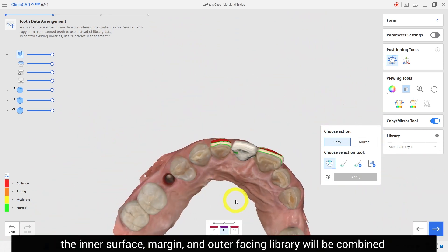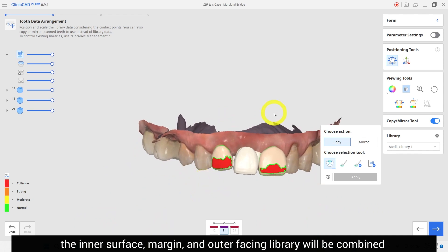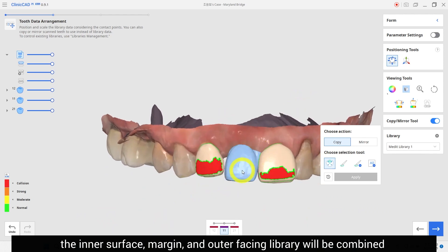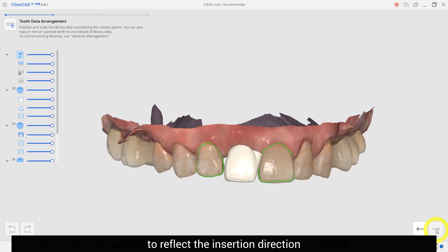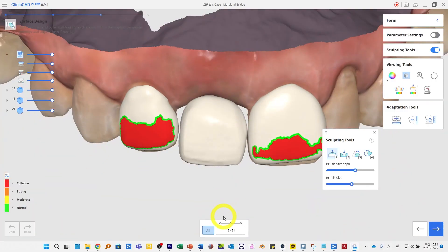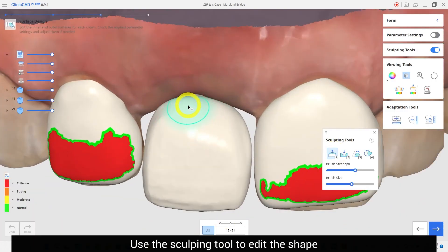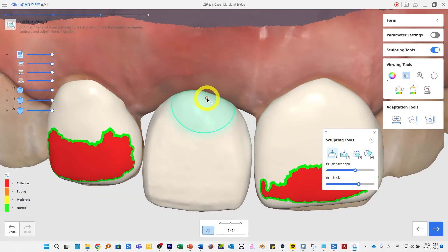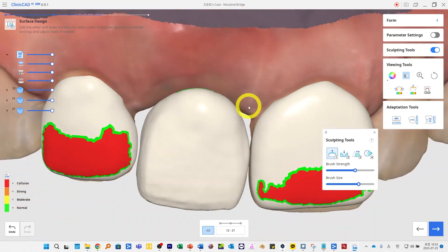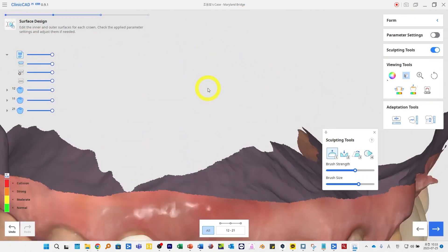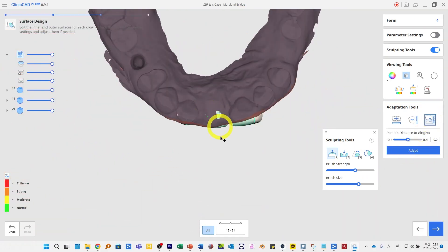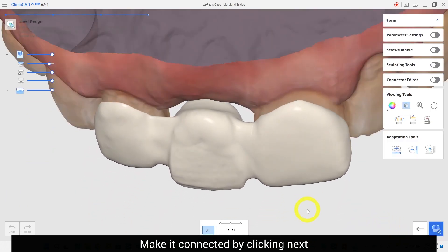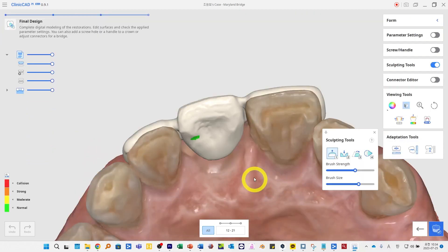Make it connected by clicking next. The inner surface, margin, and outer facing library will be combined to reflect the insertion direction. Use the sculpting tool to edit the shape, then trim the gingival of the pontic to fit. Click next to move on.